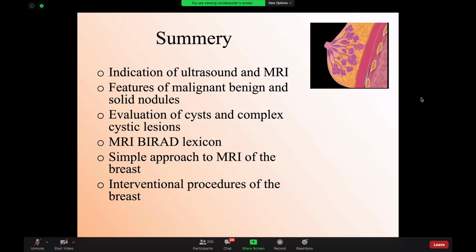Okay. One long question from Dr. Sarah. Kinetic curvature, the latest studies started to depend on the initial enhancement. If it rapidly enhances within the 2 minutes, it is most likely a malignant lesion, without giving that much concern to washout. Should we depend on that in the exam setting or on the classical way that we have been taught?